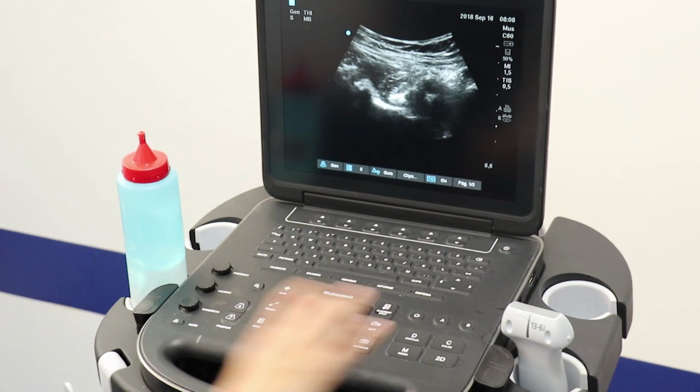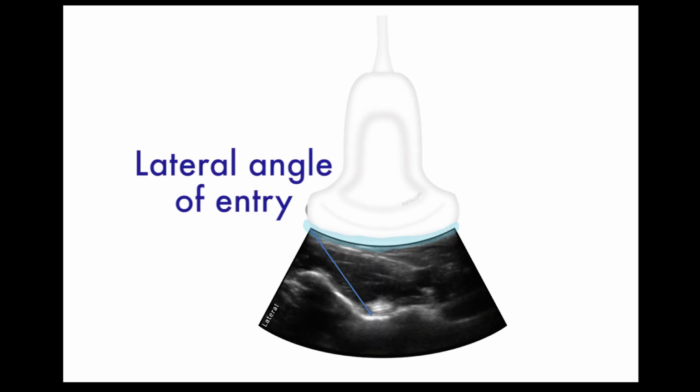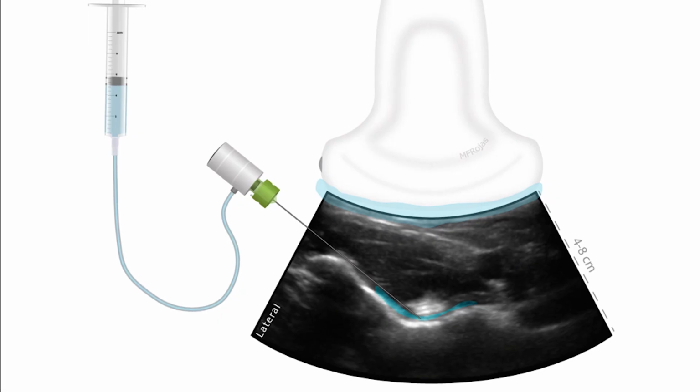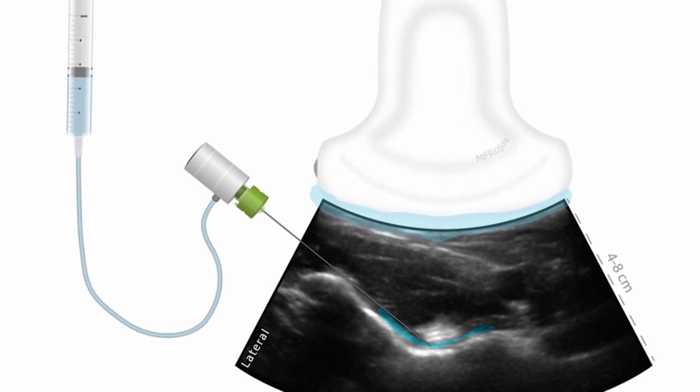If an inadequate distribution along the medial aspect is observed, the needle can be withdrawn and then directed medially, depositing a certain amount of local anesthetic at that level. This helps block the accessory obturator nerve more successfully, as its location is more medial.